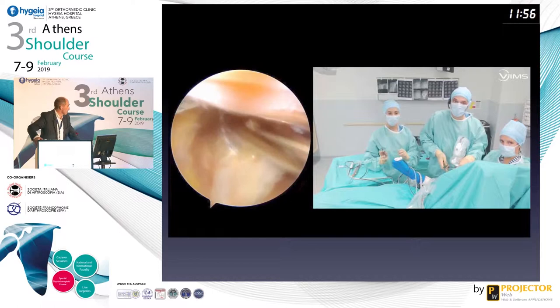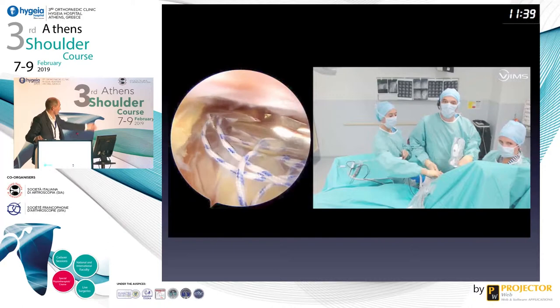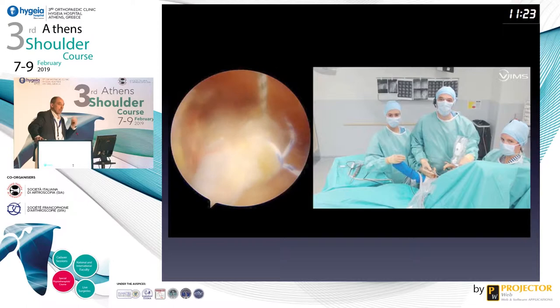So it is exactly the same technique with a triple Krakow suture, and you make a loop, and you have to manage it. The most difficult, I think, is to take care of the vessels around. You can see behind the red muscle, this is the teres major. So you can see perfectly the limit between the lat dorsi, which is still fixed at the upper part of the tendon onto the humerus. Otherwise, you will have a retraction, and this step will be more difficult to manage.